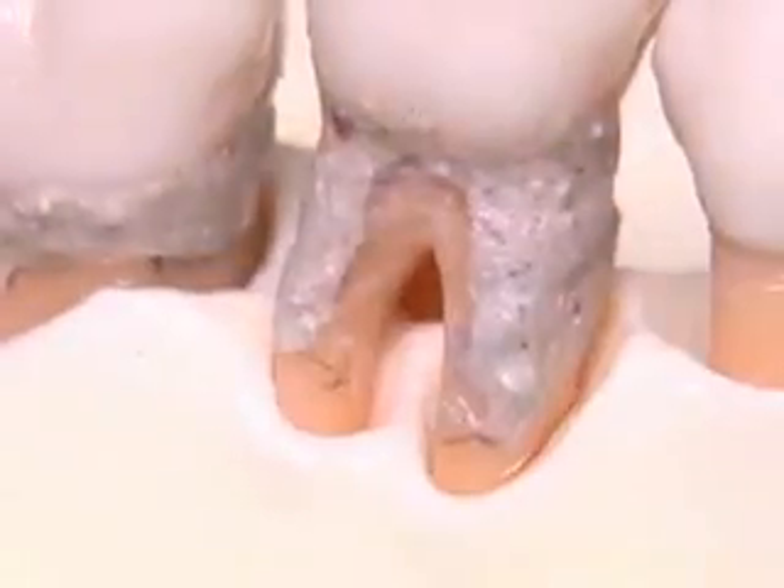Now, calculus is removed from the narrow furcation area. Dental biofilm is removed at the same time.